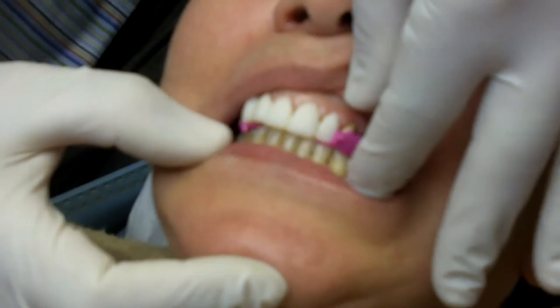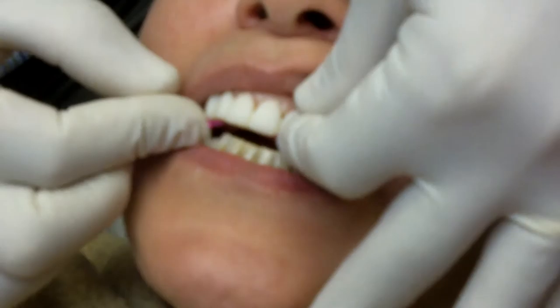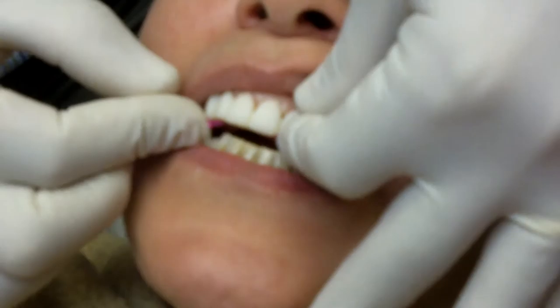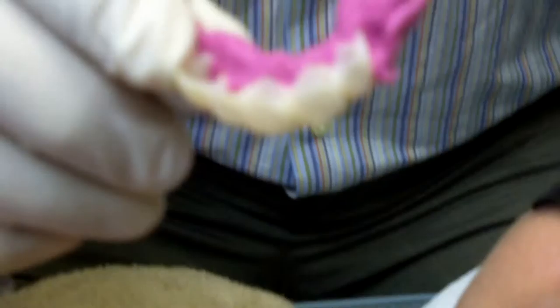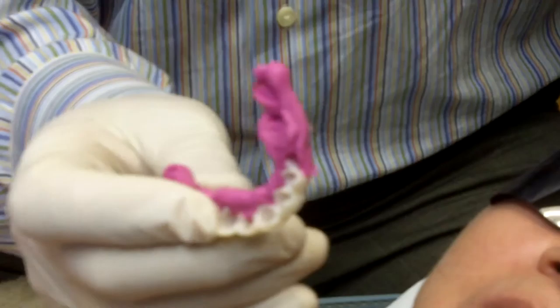As she bites down — go ahead and close — when she closes into centric, she's on anterior stops on this, so we've done futar for the posteriors. The bite registration that will go to the lab will be this entire piece with the futar and the anterior five teeth. It gives us the correct vertical dimension of occlusion and her centric occlusion at the same time.